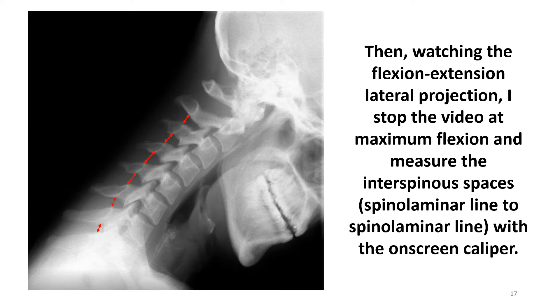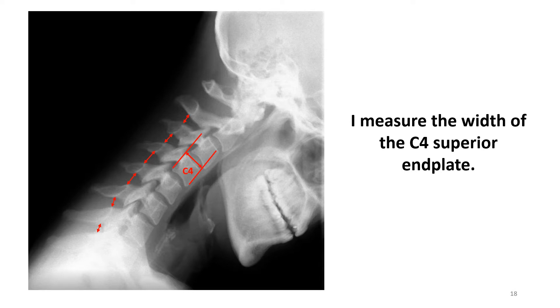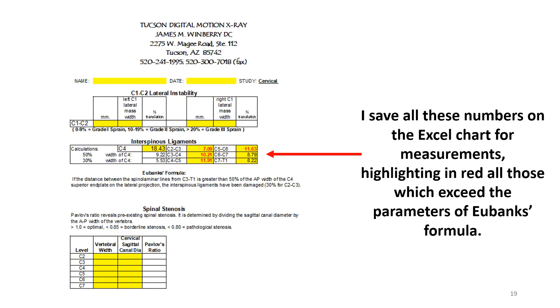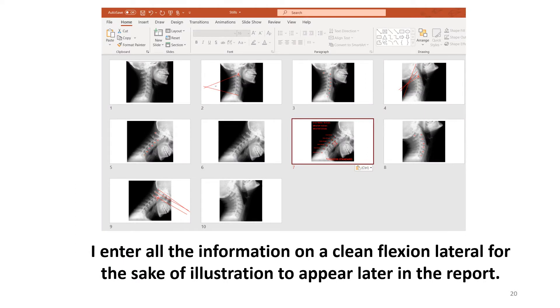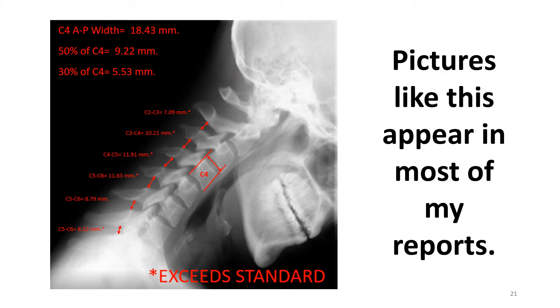Watching the flexion-extension lateral projection, I stop the video at maximum flexion and measure the interspinous spaces — that's spinal laminar line to spinal laminar line — with an on-screen caliper calibrated prior to each use. I also run the video several times to get a sense of the opening of the spinous processes, as the initiation of motion in the posterior elements starts at the top at occiput C1 and proceeds sequentially down the spine. Any variation from this order is abnormal. Then I measure the width of the C4 superior endplate and save all numbers on the Excel chart, highlighting in red all those which exceed the parameters of Eubanks' formula.